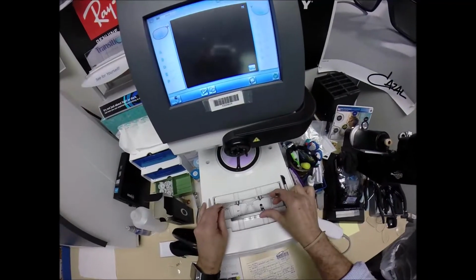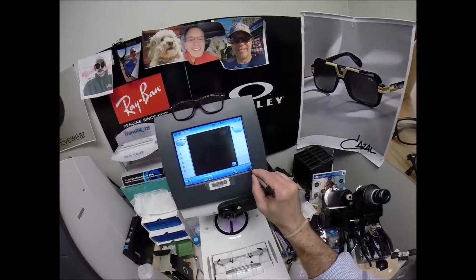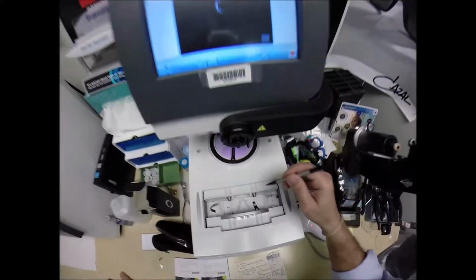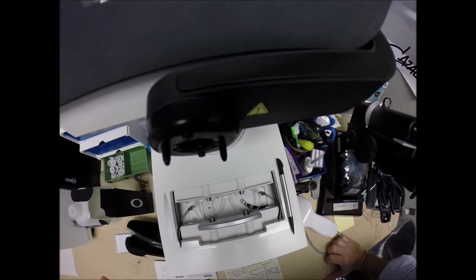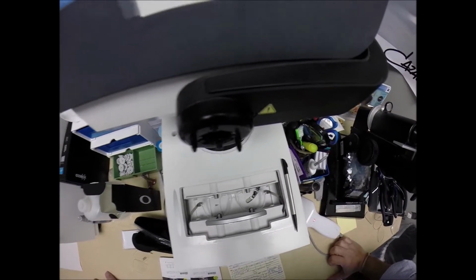I'm going to put your frame into the tracing element of my blocker and hit the start button. Little stylus is going to pop up, go around and trace the inside bevel of the right side of the frame before doing the same thing on the left.